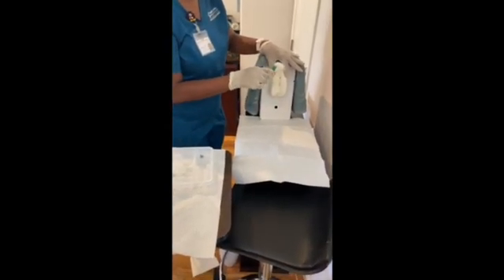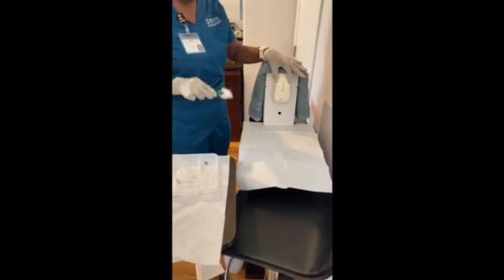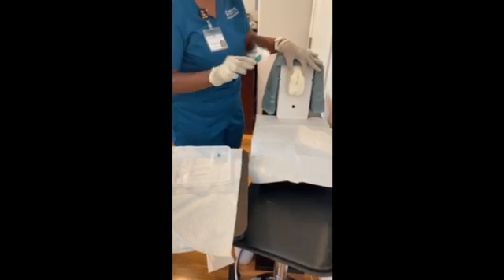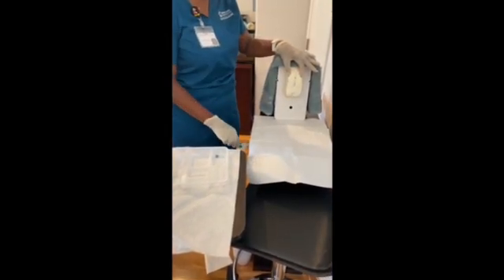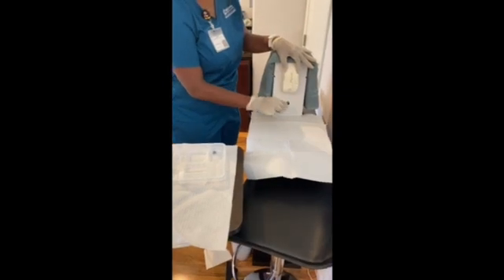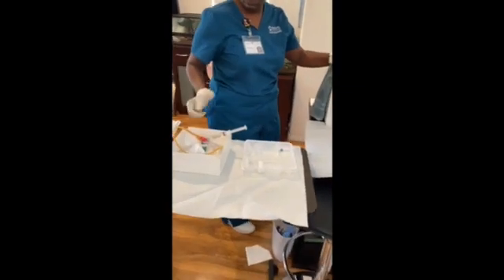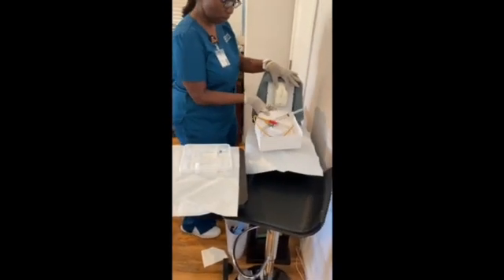Furthest inner labia, one swipe down. Closest inner labia, one swipe down. And there should be another cotton swab in here for one swipe down the middle. Sterility was lost during the fourth swipe due to my hand dropping below waist level. At that time, I would have to start over from the beginning.